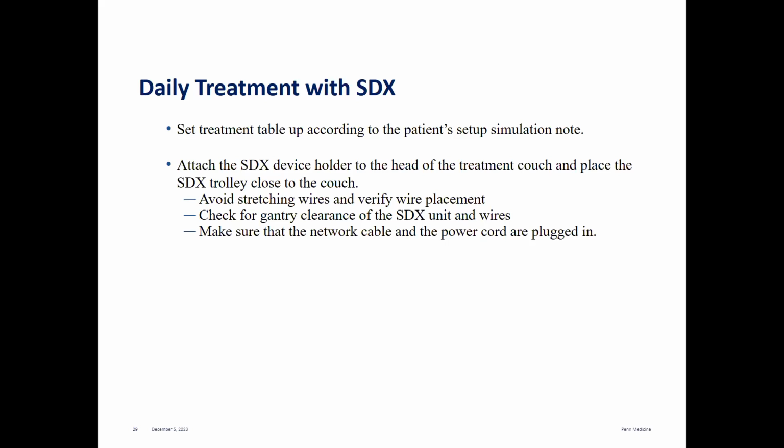Then you will attach the SDX holder to the head or at the top of the table and place the SDX trolley close to the couch, but make sure it doesn't get hit or anything. You always avoid stretching wires, and you have to verify the wire placement to make sure the gantry clears and the imagers before you leave the room. So check the gantry clearance of the SDX unit and wires. And you make sure the network cable and power cord are plugged in and everything works.